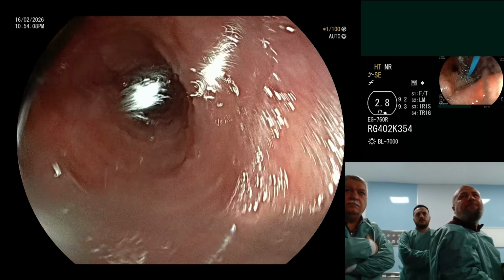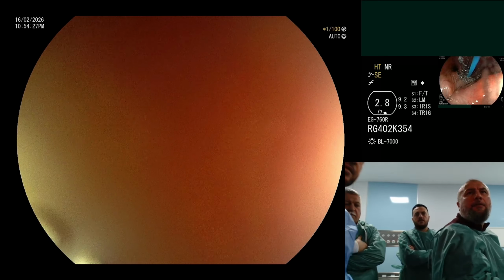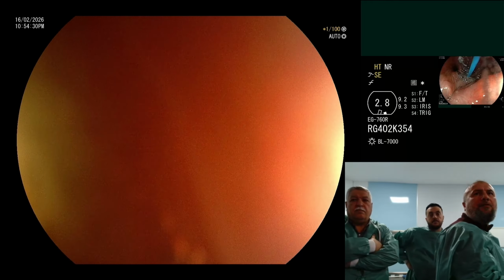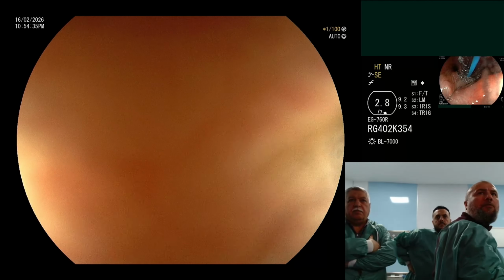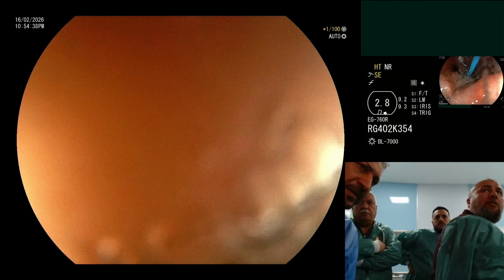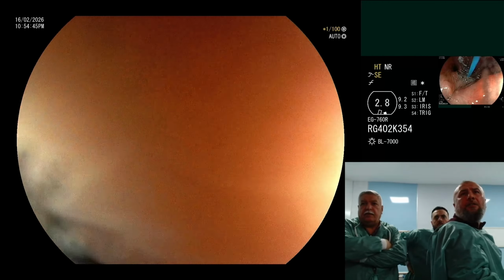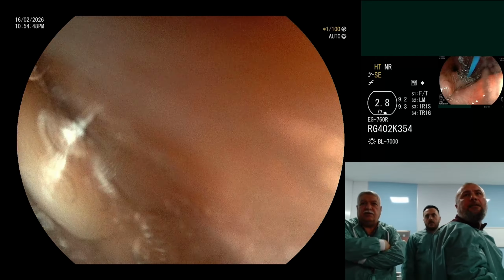therapeutic if possible. When we do gastroscopy, in the esophagus we found a large meat piece in the lower part of the esophagus. Our plan at this moment is, if we can bypass it and reach the stomach and look at the GE junction, and if we can assess the GE junction and find that it is good enough that we can push the food into the stomach, we can do that. If we cannot do that, our next plan, or plan B, is to do removal from the mouth.